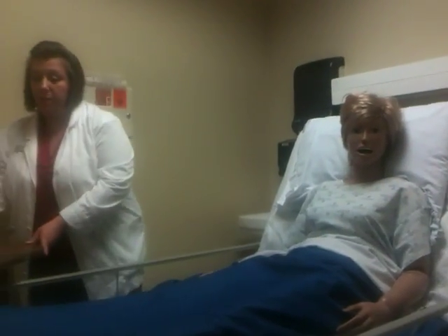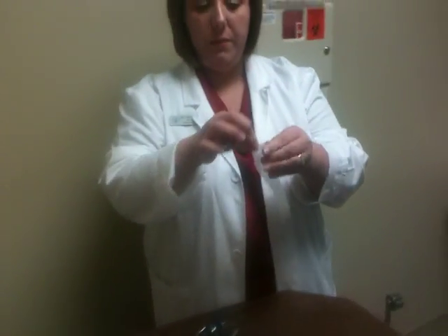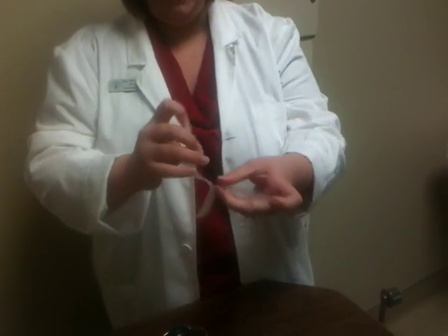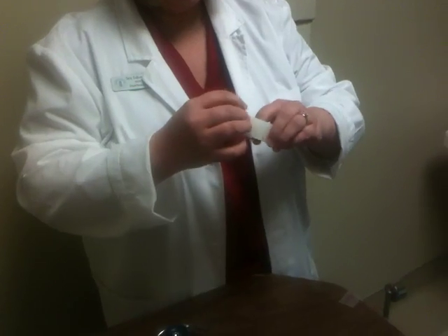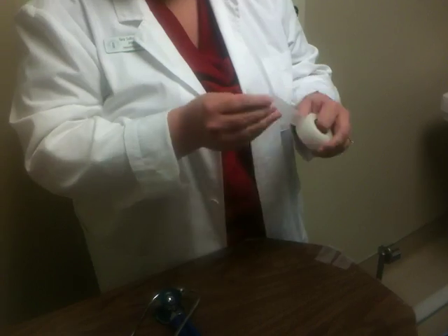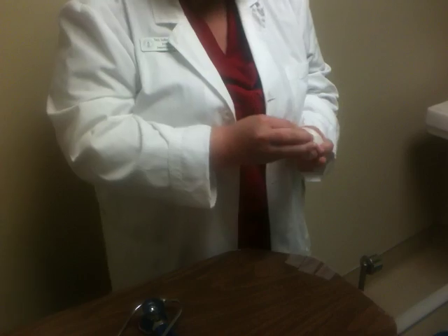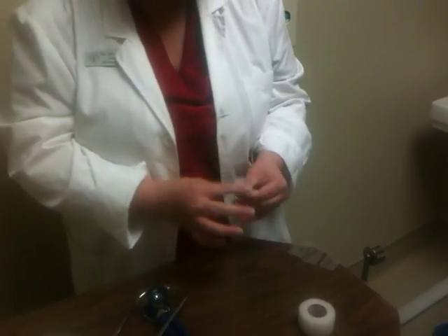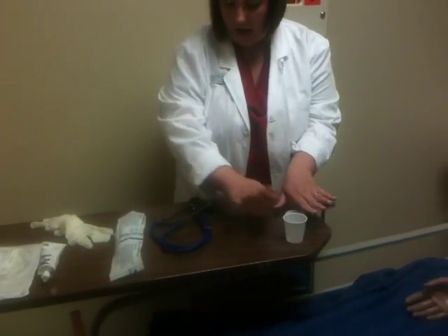I'm going to go ahead and start preparing my equipment now. I'm going to take my tape. I'm going to do one piece and tear it in half like a pair of pants. I'm going to take a piece of tape to secure it to the cheek, a piece of tape to mark the tube, and then a piece to put across the bridge of the nose. Okay? Alright. Go ahead and get my ice chips handy.